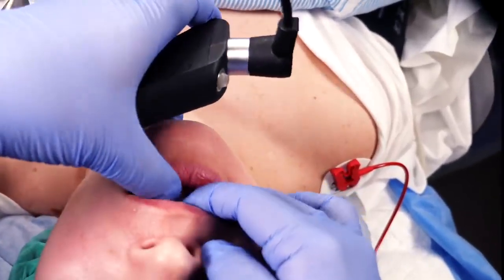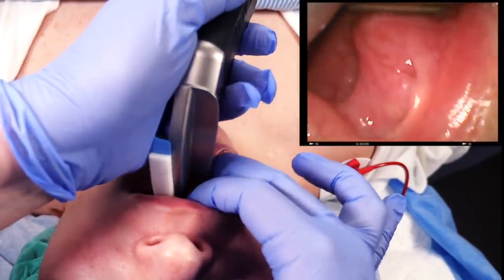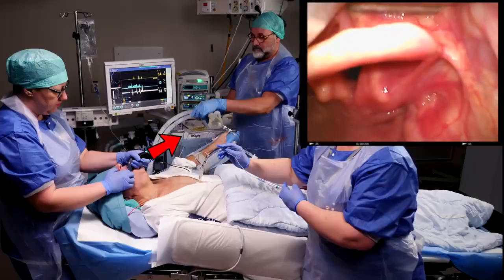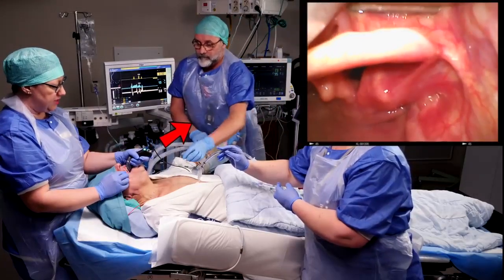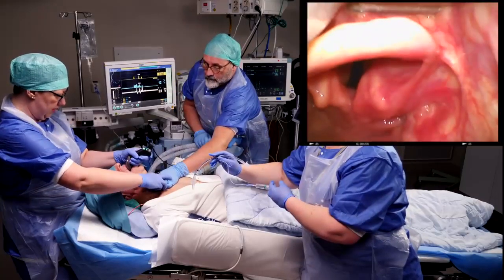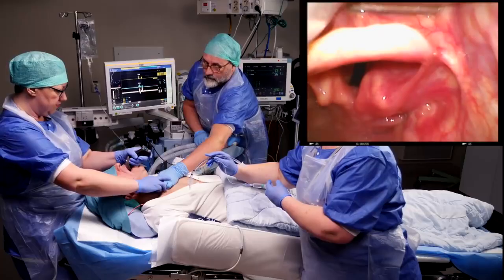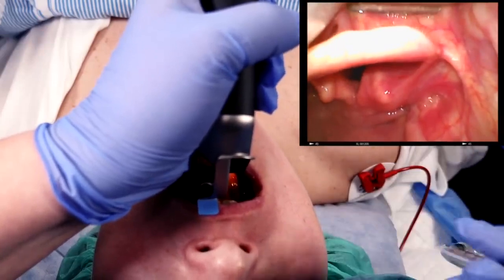Let's see the laryngoscopy once again. Advance the blade until you see the epiglottis and place the tip in the vallecula — the recess at the base of the tongue. At this point you can start to apply some force in the direction of the laryngoscope shaft. Sometimes a light external force on the larynx can make the vocal cords spring into view. Ask for your assistant's hand and move it to apply backwards-upwards-rightward pressure, or BURP for short. Make sure you don't pinch the lips and do not exert any pressure on the front incisors.